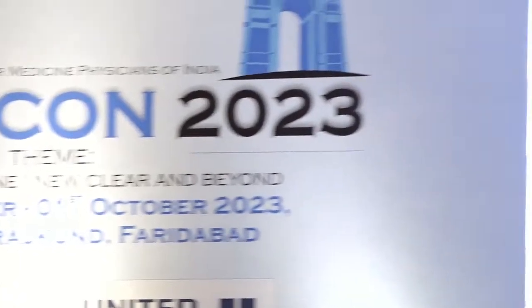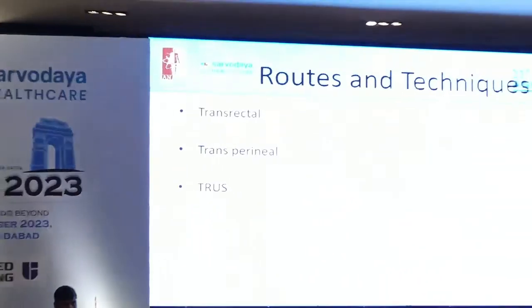All of these have a very negligible chance of picking up the lesions. If you are doing it by digital examination, you will target the nodules only. If you are doing it under MPMRI, you are targeting PIRADS lesions, which will also have lesser sensitivity as compared to PSMA PET CT. There are many approaches described. I'm not going to discuss the approach here because of very little time.